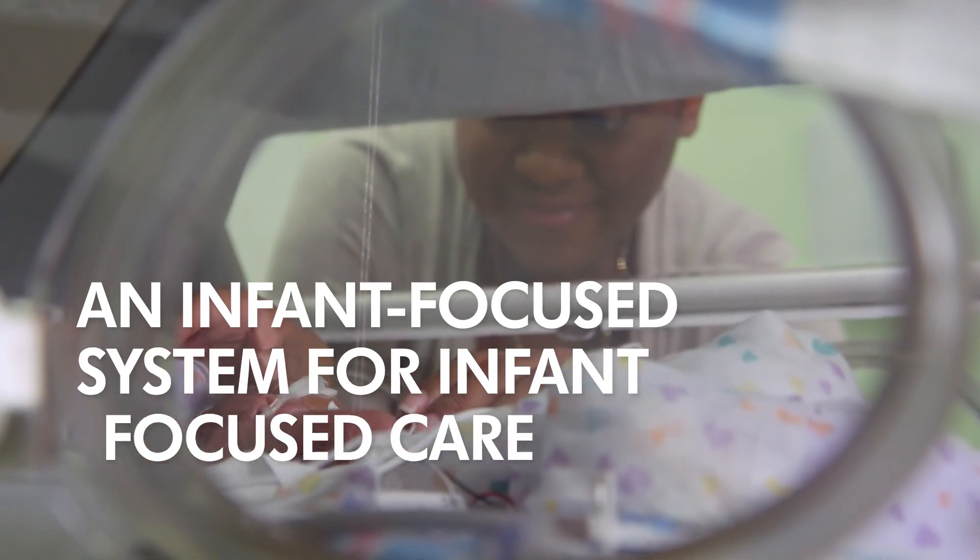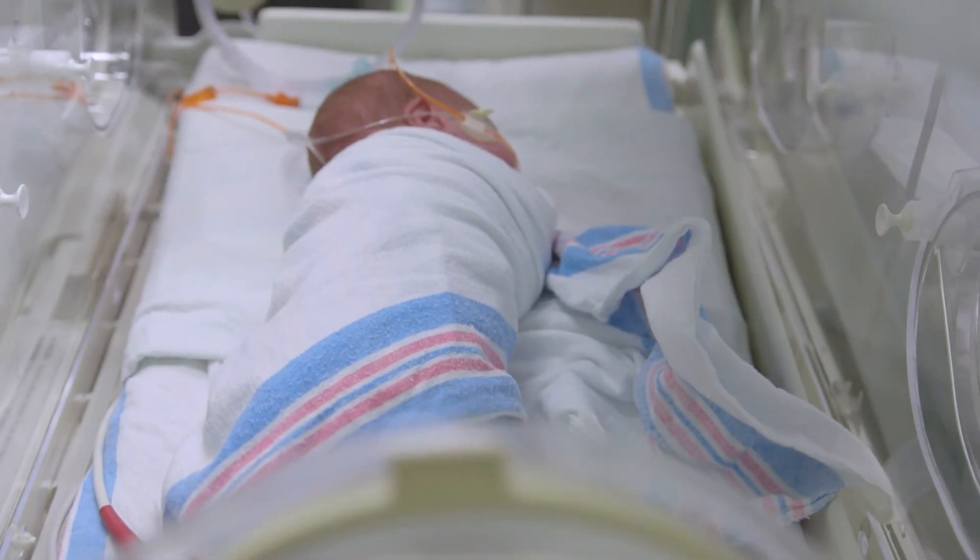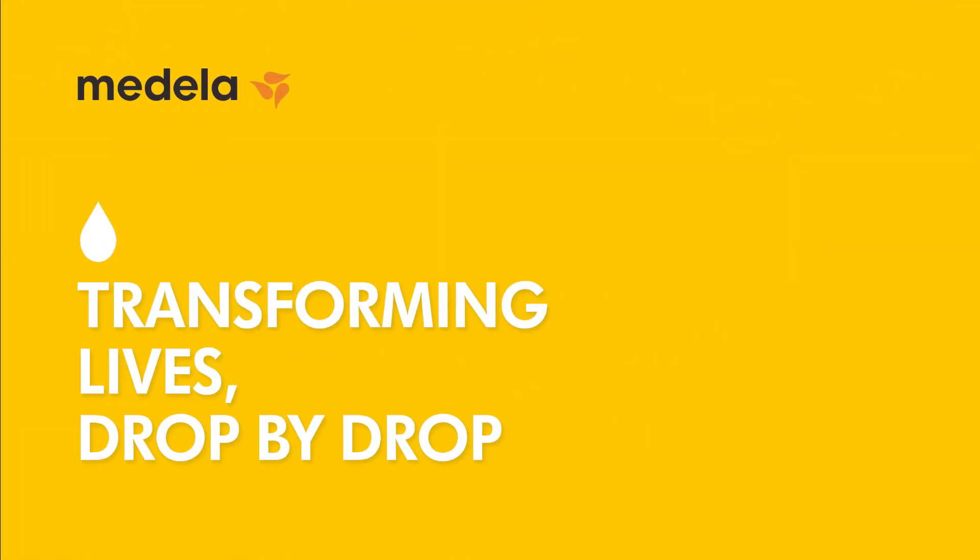Tailored to meet the unique needs of neonates and built for the demands of the NICU. Because nowhere is the power of human milk more apparent than in the NICU — it's where drops save lives and small details matter.